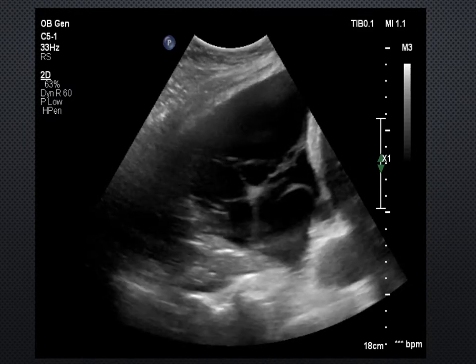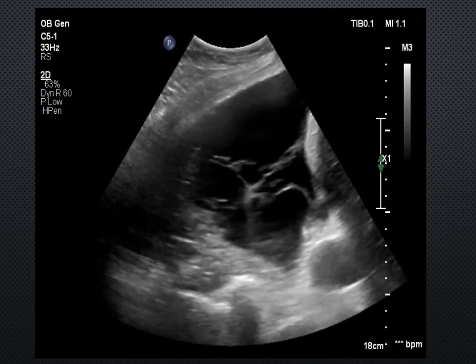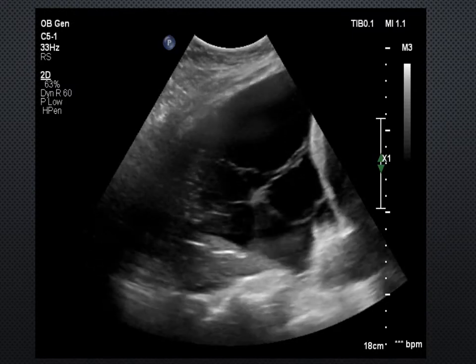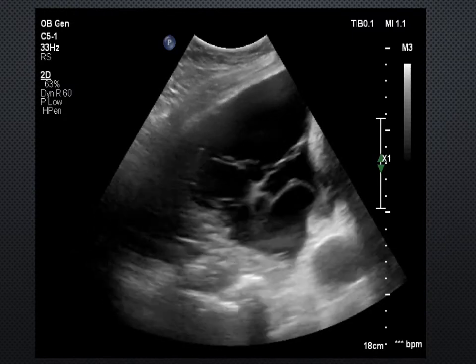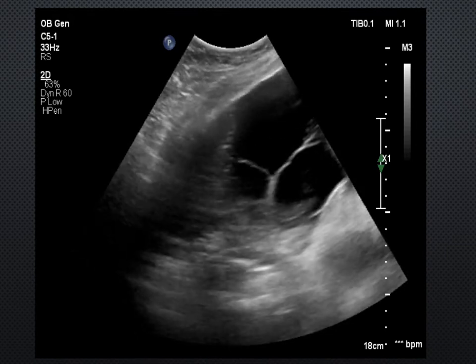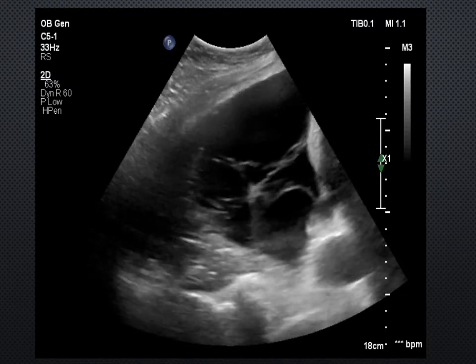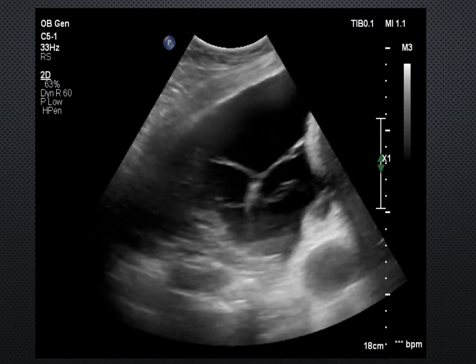Looking at here, what we can see is that we've got the diaphragm at the posterior aspect, as we're seeing in a curvilinear. You've got some indication of the lung just above there, although it doesn't look to be very well aerated. It looks quite dense, consolidated in nature.